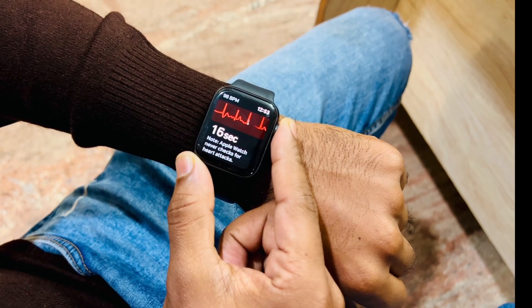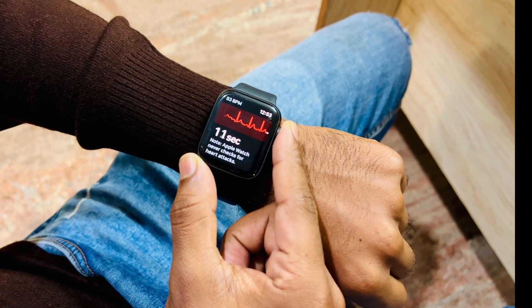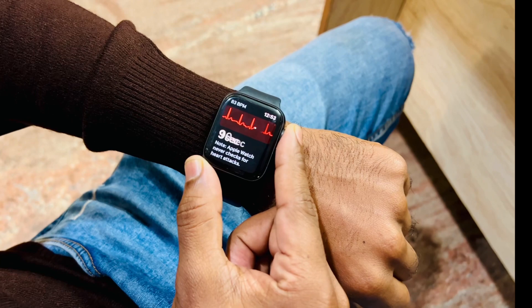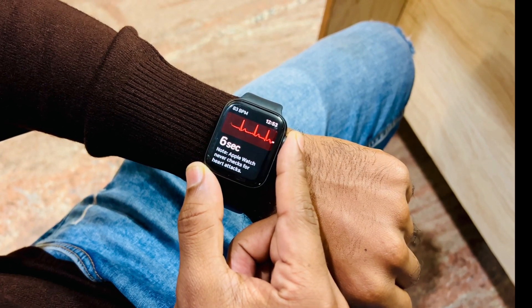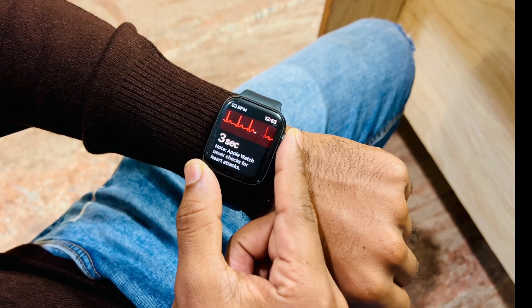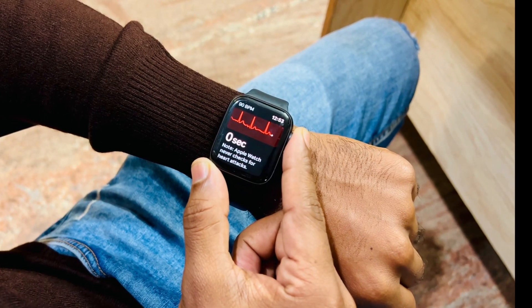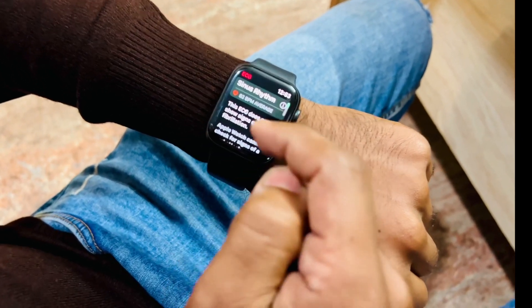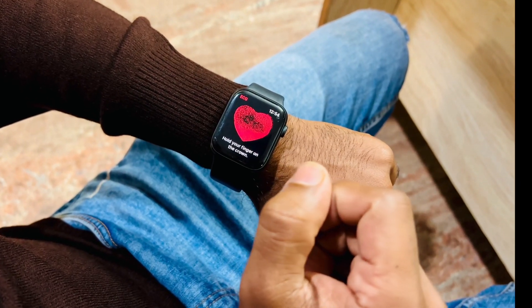Let me show you the result. It basically takes 30 seconds for measuring your ECG, and you can even export this as a PDF file for your doctor. Now it's done and I will show you on my phone.